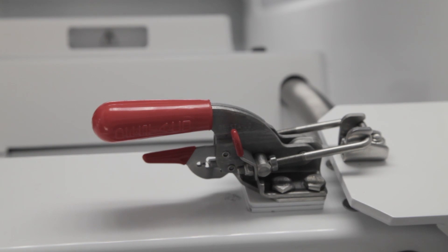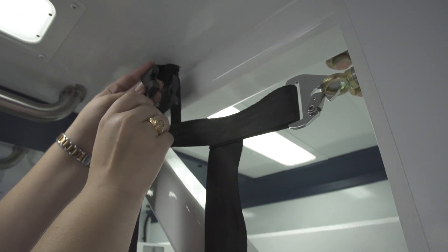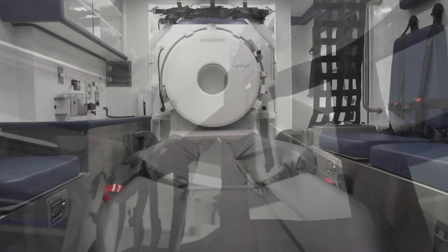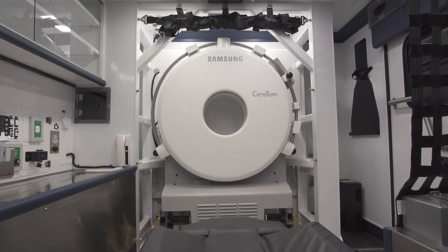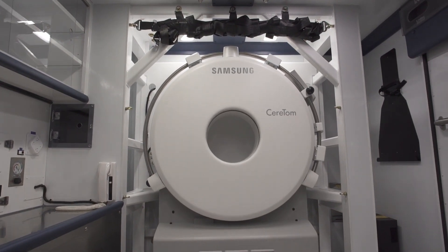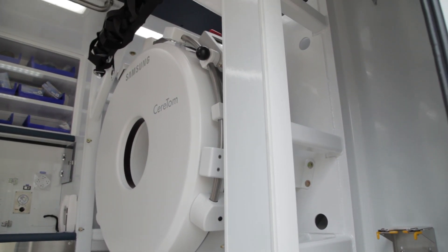We didn't only want to restrain the scanner and have our mount strong enough, then ignore it if the scanner came apart. We also wanted to contain the scanner if it were to come into pieces. The current retention system we have today resembles a roll cage you'd find in a race car, but it's obviously much more substantial and much bigger.